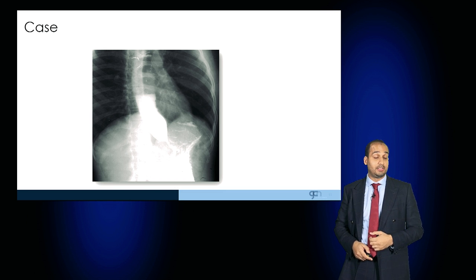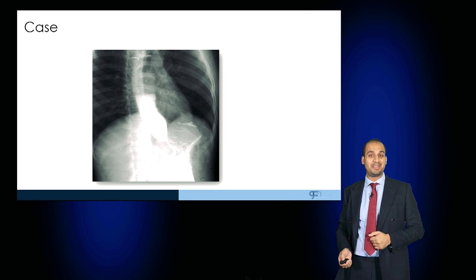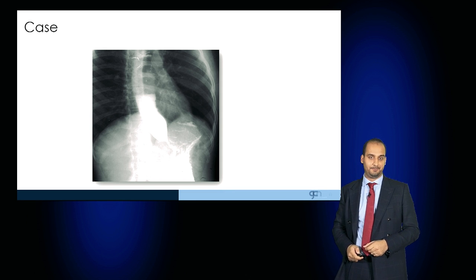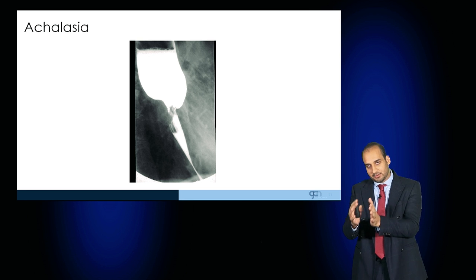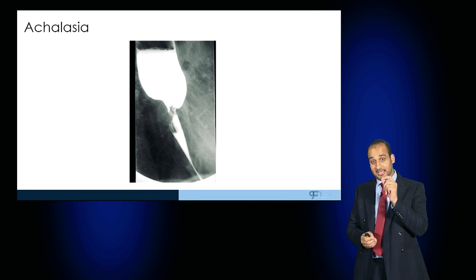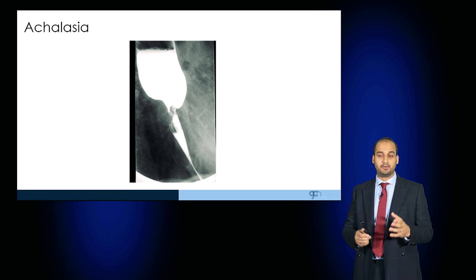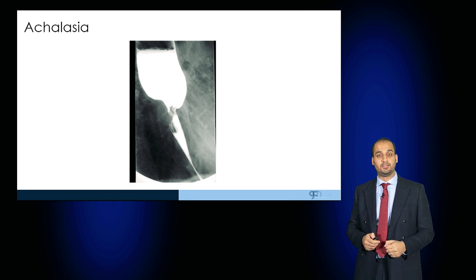This image, a barium swallow, demonstrates the contrast and you can see the bird beaking of the oesophagus at the very end — that tapering of the oesophagus — and this is known as achalasia. Here is another more detailed image of achalasia, described as a bird beak appearance. You can see that this would cause the patient severe dysphagia and require oesophageal dilatation or surgical intervention.